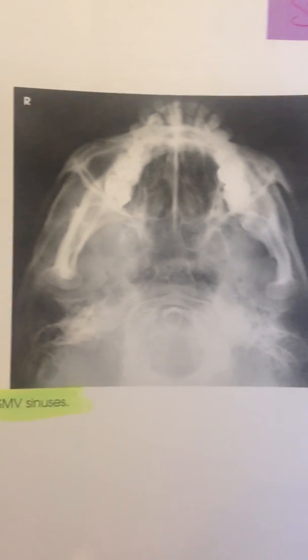And then that is all for the criteria of all of the images of the skull series.